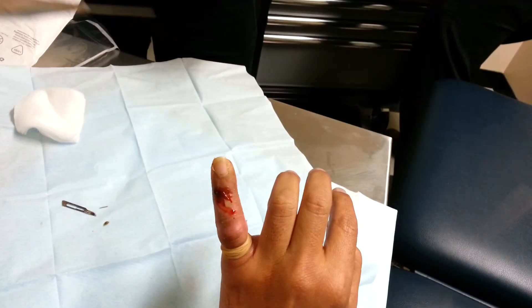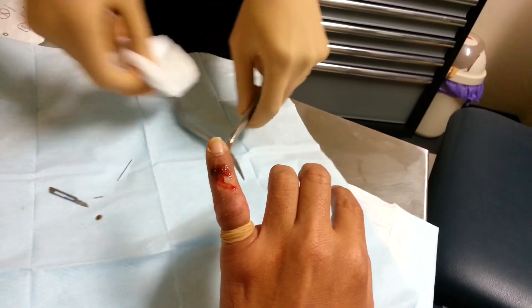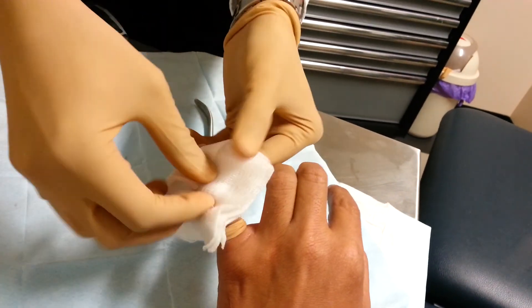There it is. Oh sweet. It's all done? Yep. A little dressing, and then we can put it on.